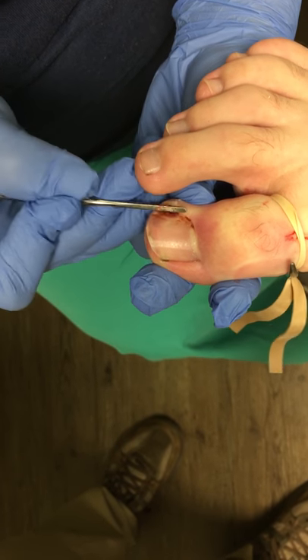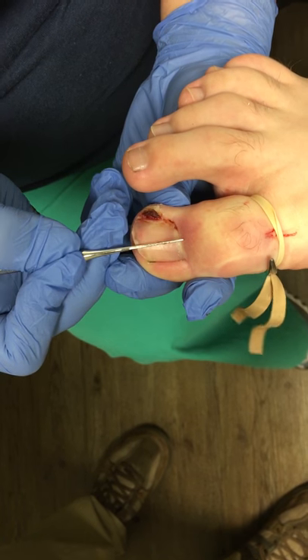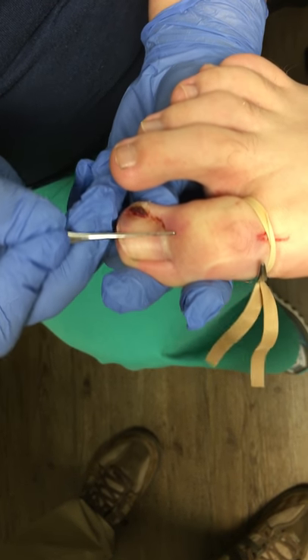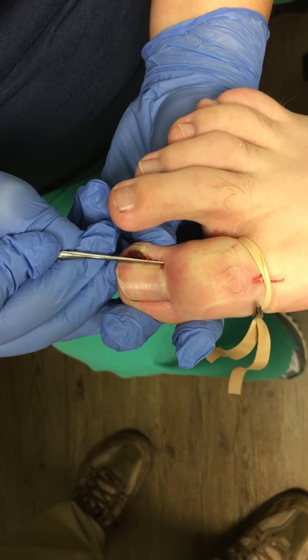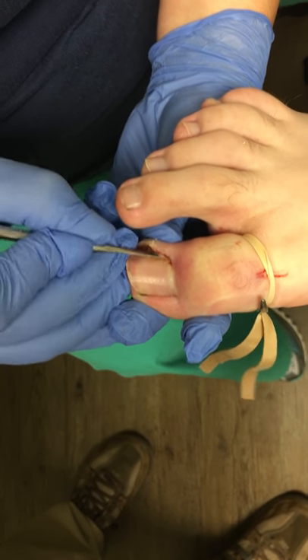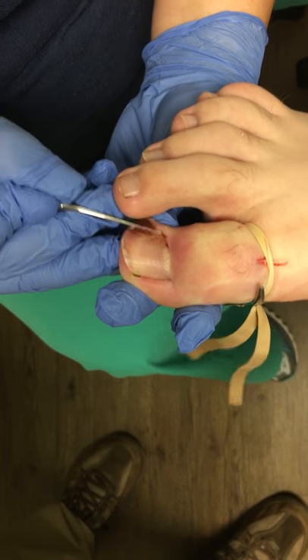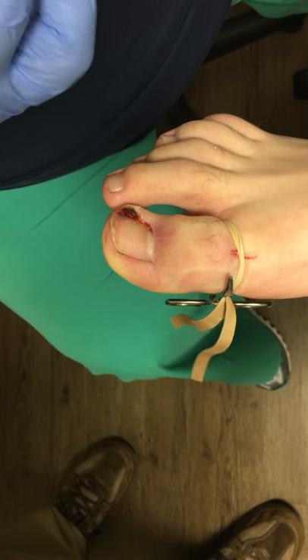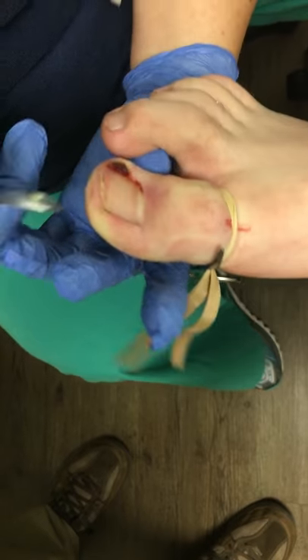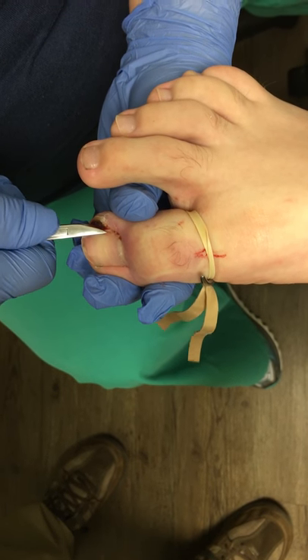With a matricectomy, it's also a cosmetic procedure. I don't want to take off too much nail — that would leave an abnormal result. We're going to aim to still have what looks like a cosmetically normal nail. So you should be able to just wisp right around like that. We use a nail cutter to start, followed by a beaver blade, and we go down the border, following that cosmetic line we just made.